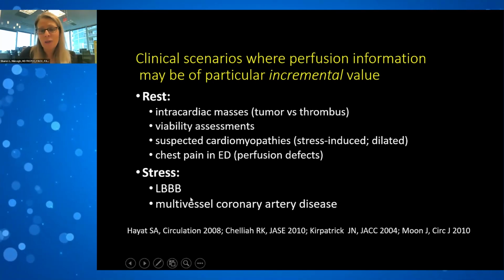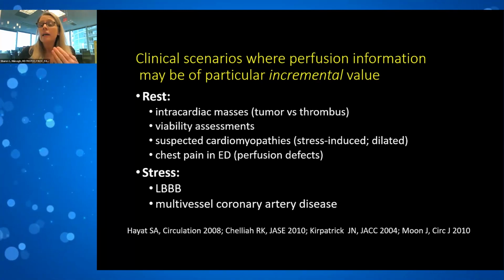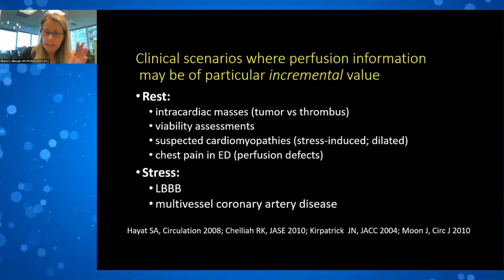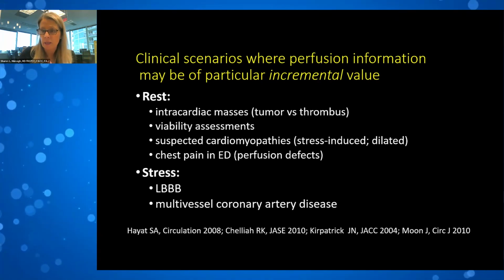And then also, Jordi mentioned a little bit about use of contrast perfusion in addition to our stress testing with patients that have left bundle branch block pattern, when it's very difficult to assess the wall motion because of the dyssynergy that is created by the bundle branch block.